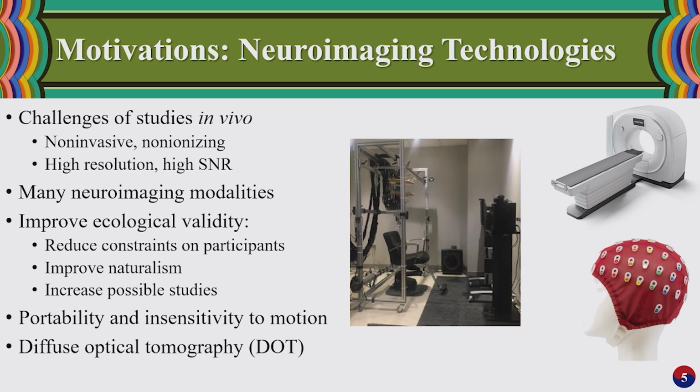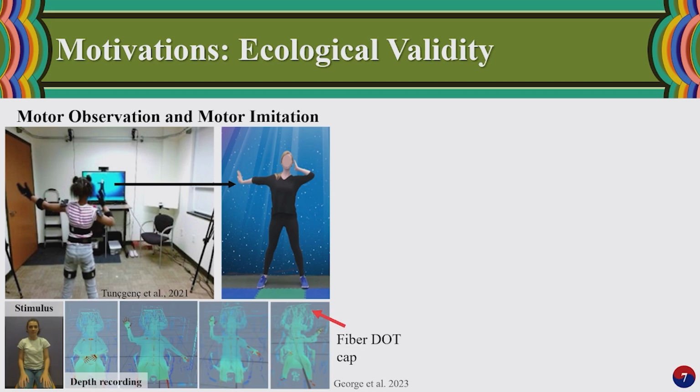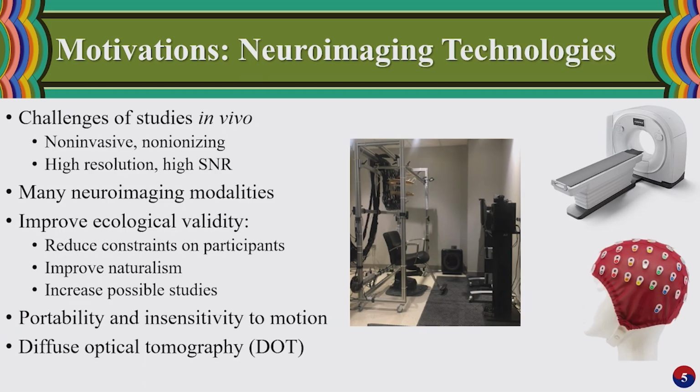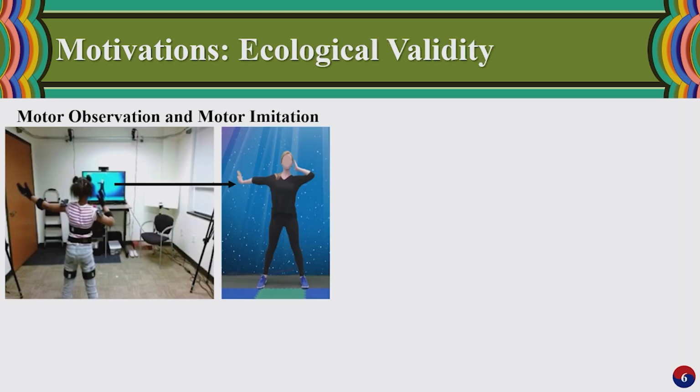This is where diffuse optical tomography comes in. While not as widespread of a technology as EEG and MRI, it possesses useful capabilities, offering greater insensitivity to motion with some degree of portability.